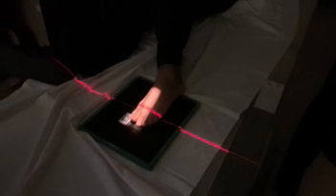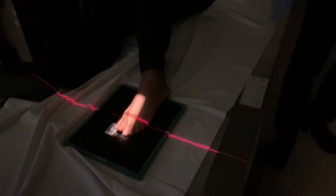Laterally. So 1, 2, 3 is internal, 4 and 5 is external. Now take a look at his leg right now. His leg is internally rotated, correct? Yes. Right? His leg is internally oblique. But look at his foot. Is the foot internally oblique? No. It is not, right?